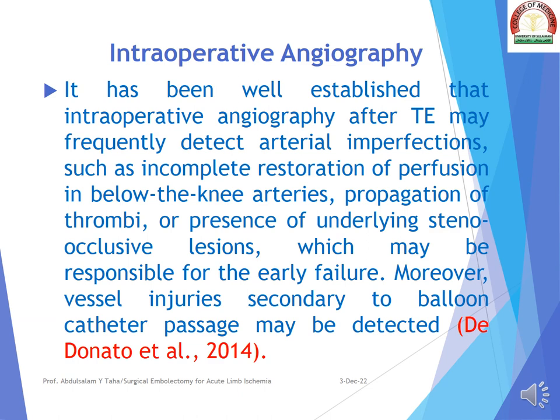Intraoperative angiography. It has been well established that intraoperative angiography after thromboembolectomy may frequently detect arterial imperfections such as incomplete restoration of perfusion in below-the-knee arteries, propagation of thrombi, or a presence of underlying steno-occlusive lesions, which may be responsible for the early failure. Moreover, vessel injuries secondary to balloon catheter passage may be detected.